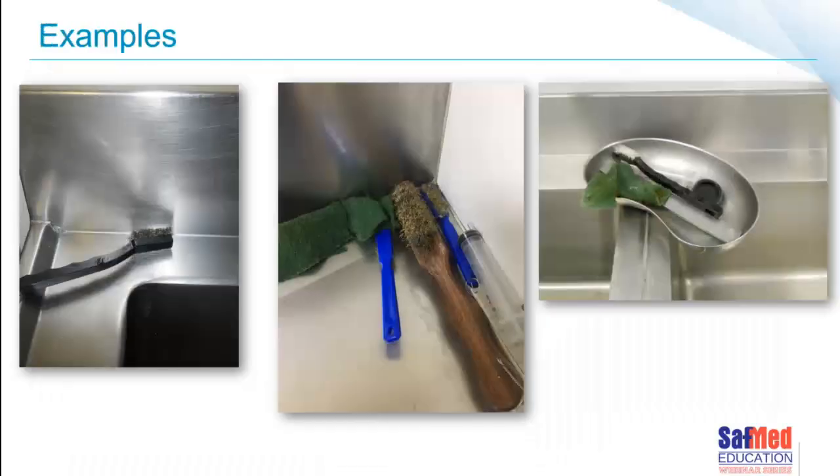Again, images from the field: metal brushes that I've seen, brass ones. The brass ones are quite soft, so they do actually fall quite quickly and they don't recover easily and stand back up again, those bristles. Whereas the stainless steel ones tend to be a little bit hardier, but even though they're hardier, they're going to damage. So really something you need to consider.